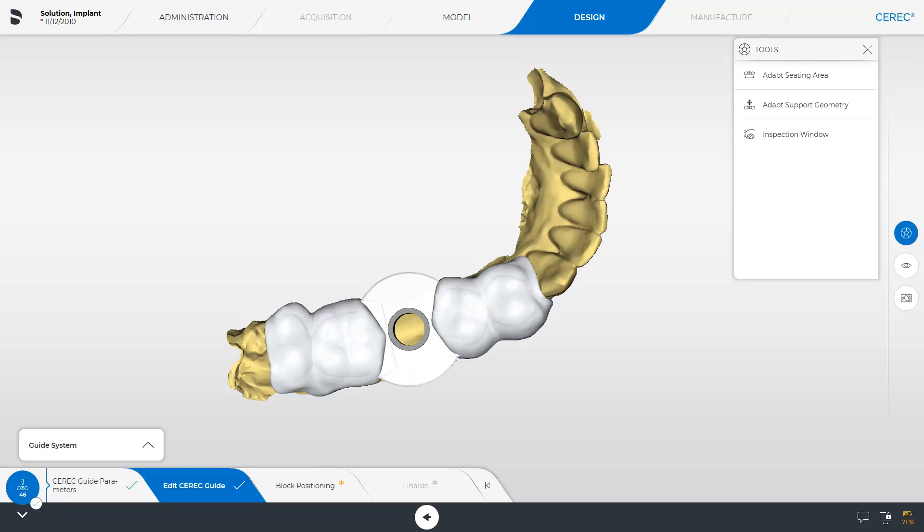Our case contains an implant planning for a CEREC Guide 3. The design workflow for a CEREC Guide 2 is similar. After importing the implant planning data, we automatically receive a design proposal.